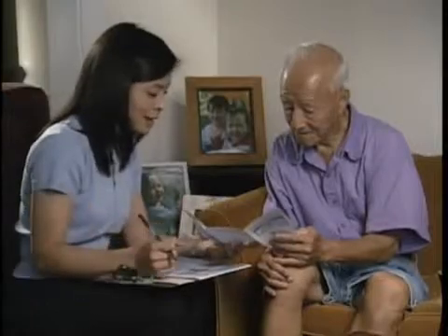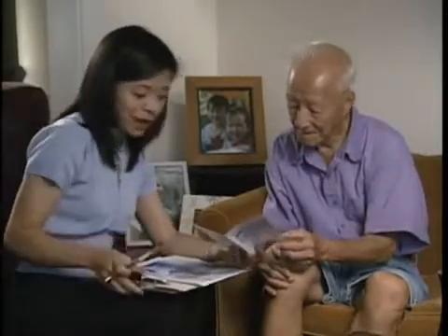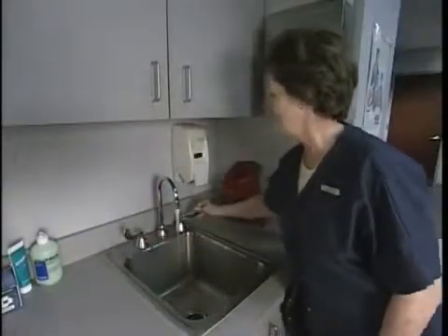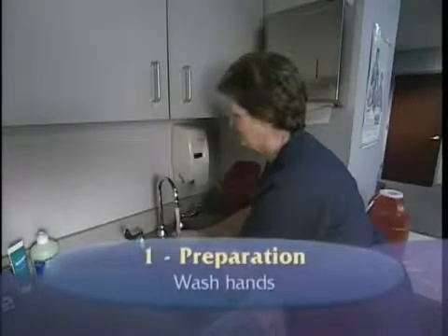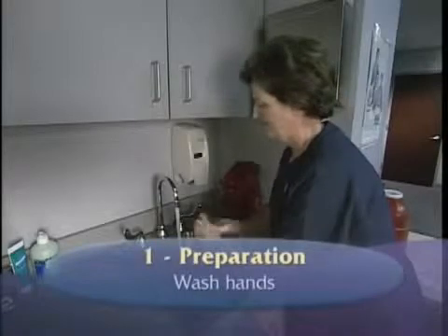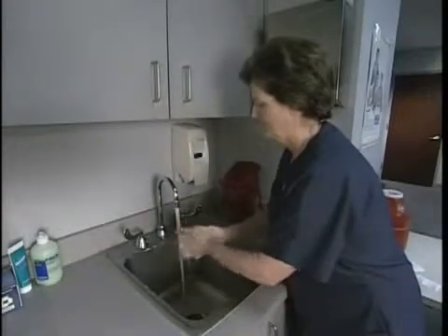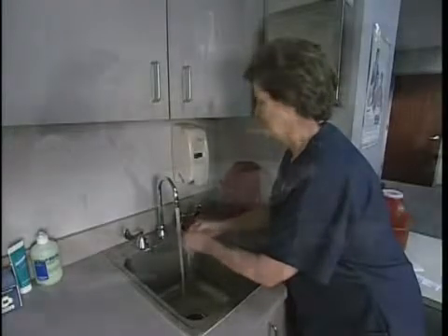Consult local practice to find out how best to document informed consent in your setting. After providing patient education, you should wash your hands using an appropriate hand washing technique before administering the test or any other procedure involving patient contact. In certain field settings, it may be necessary to use other hand hygiene techniques.